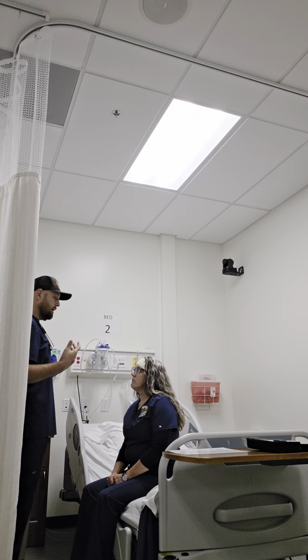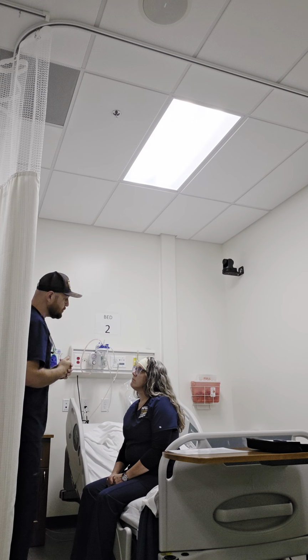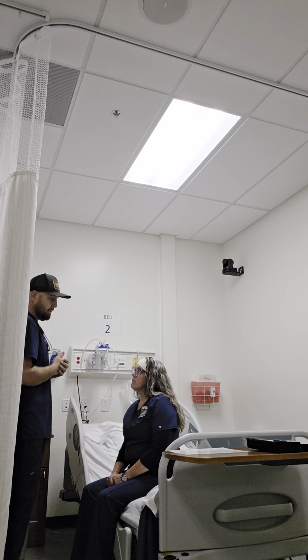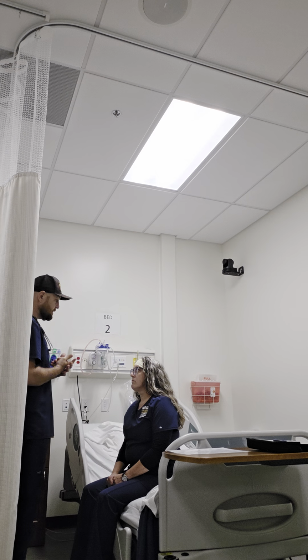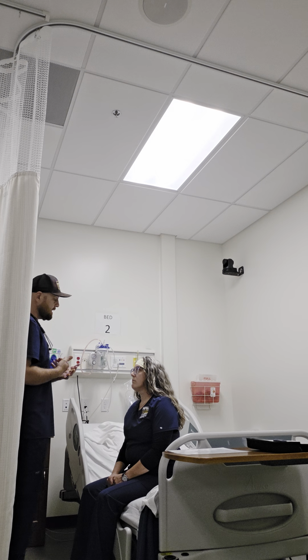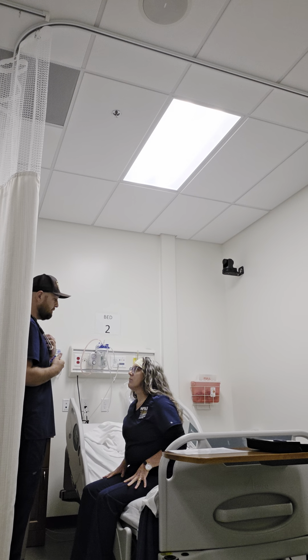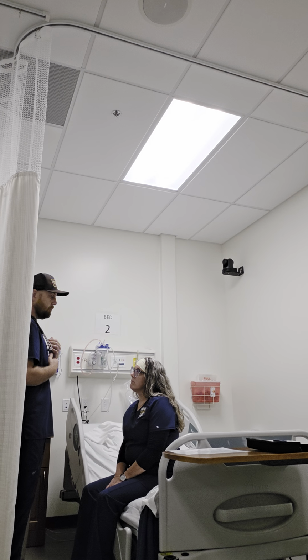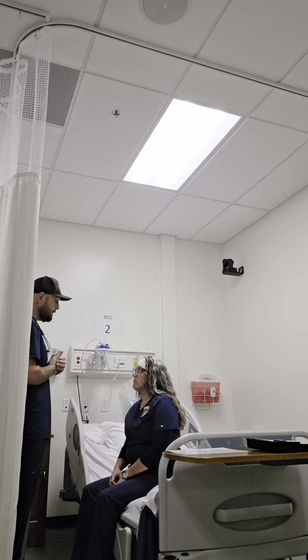I want to highlight that the S1 and S2 were auscultated with the diaphragm of the stethoscope, and the S3 and S4 were auscultated with the bell of the stethoscope, with no murmurs noted.